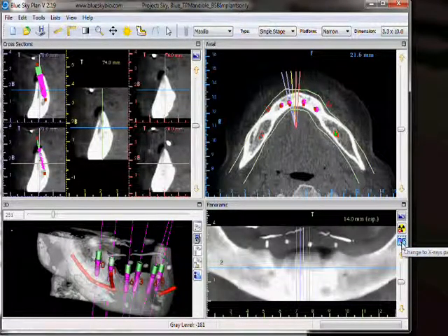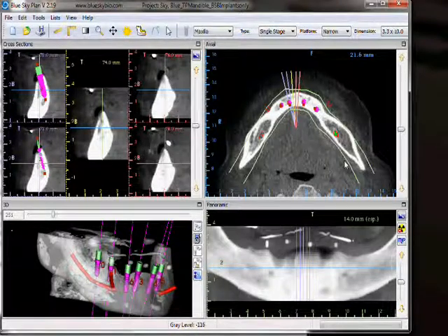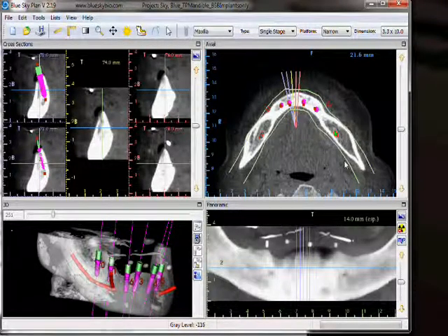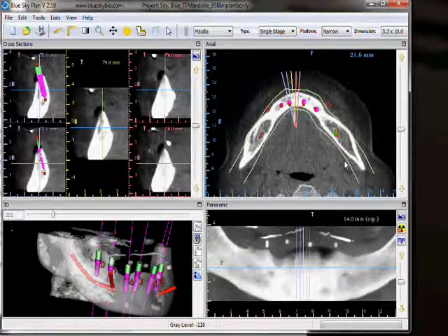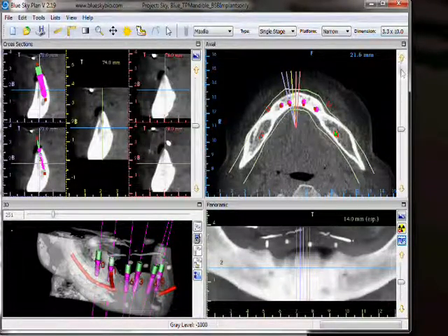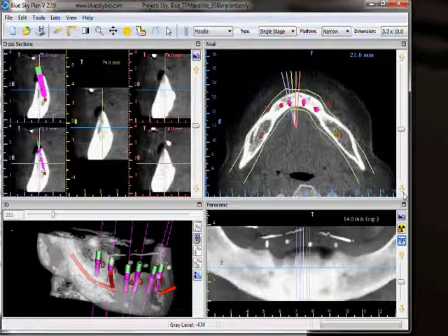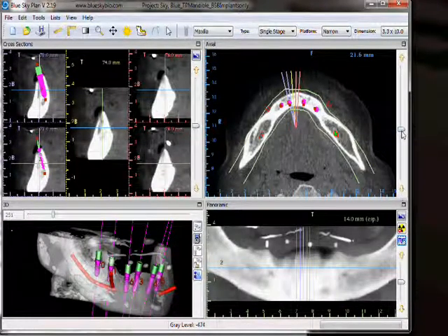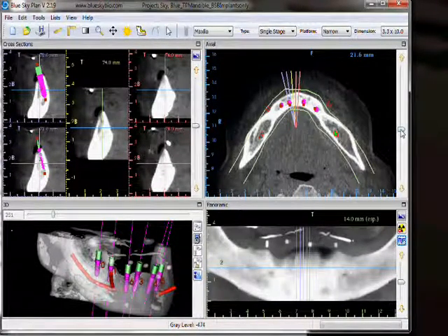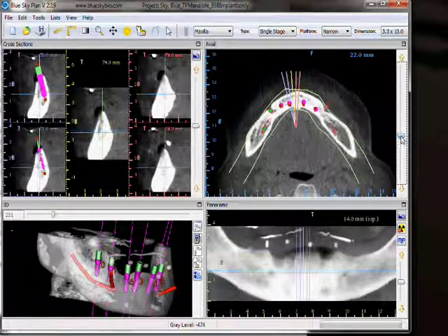Moving along to our axial view, the axial view shows us horizontal slices stacked like a deck of cards. We are able to flip through those slices by using the up-down arrows to the right. We could also grab the slider and move that, or use the wheel of our mouse.